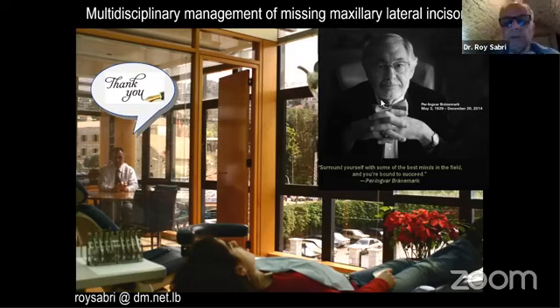But it's important to angulate the bracket. If you're closing the space, make sure to stress root parallelism. Look at your radiograph, see where the roots are, and bond the bracket accordingly, even in space closure.